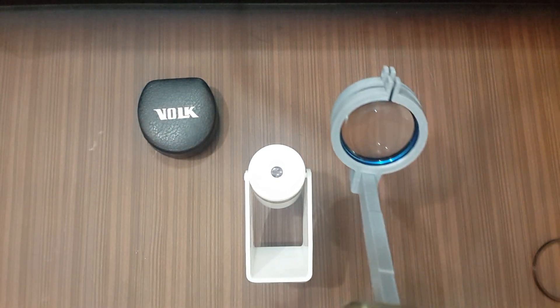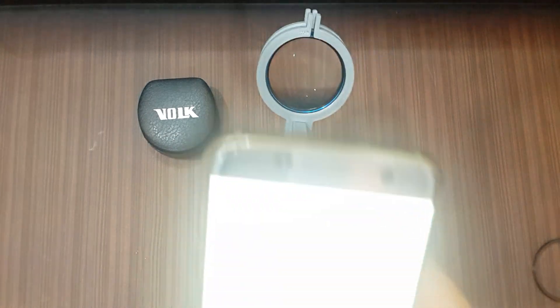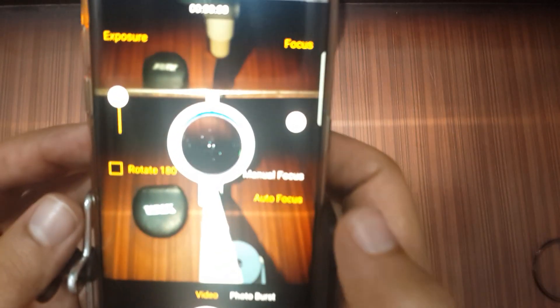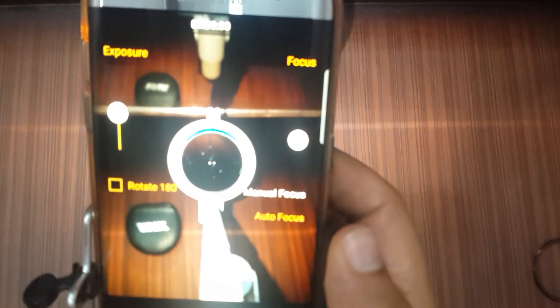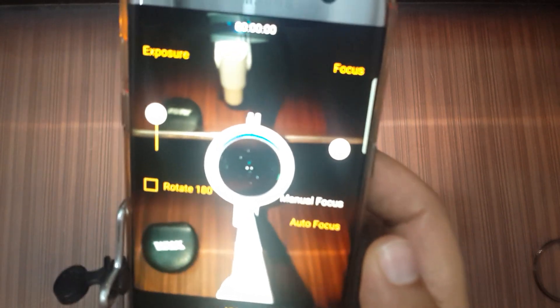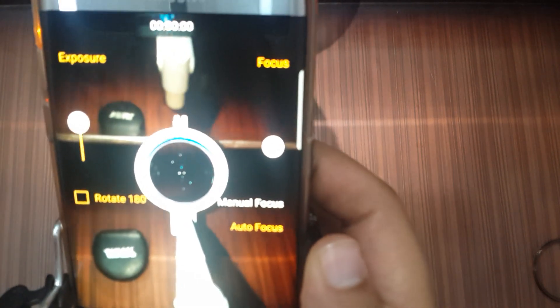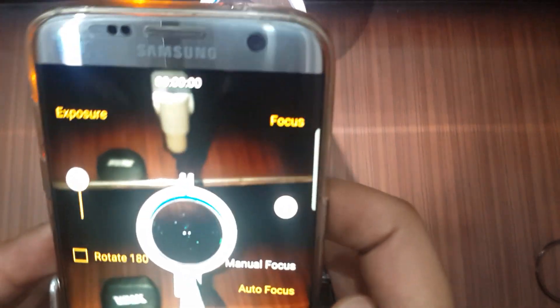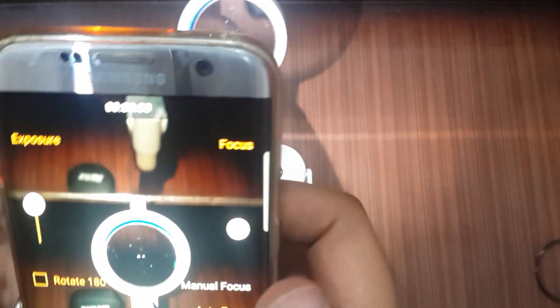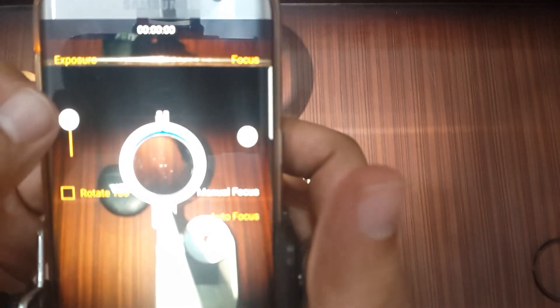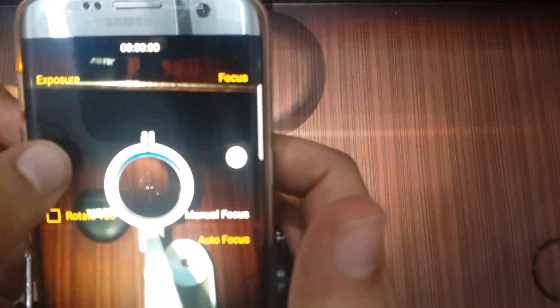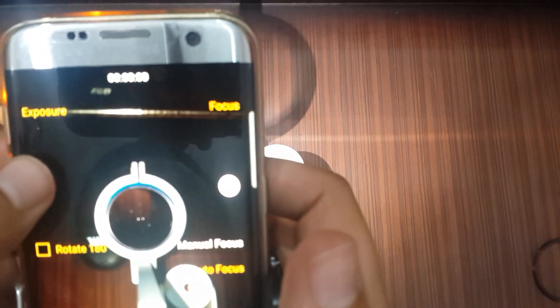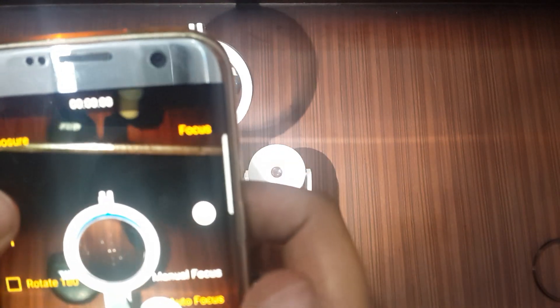Here I can open the Allman Indirect. It instantly opens the flash. Exposure can be modified — reducing the exposure reduces glare and brightness.